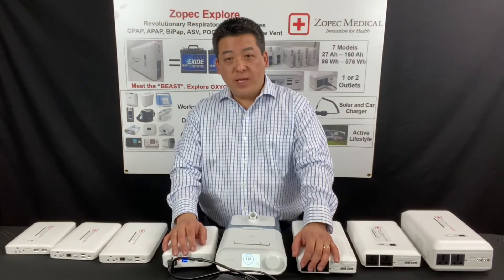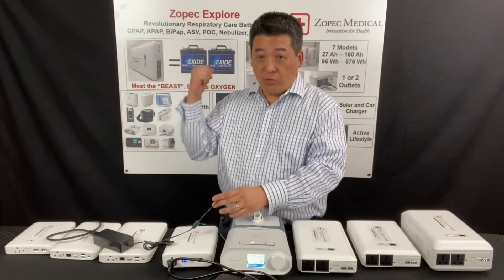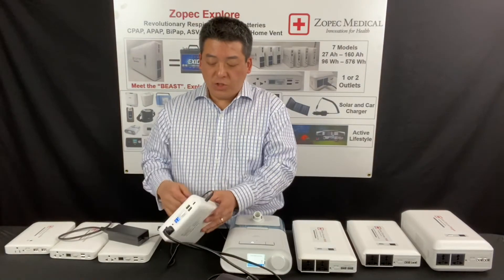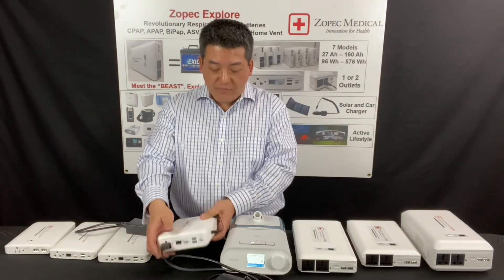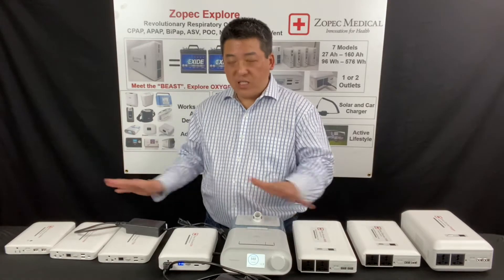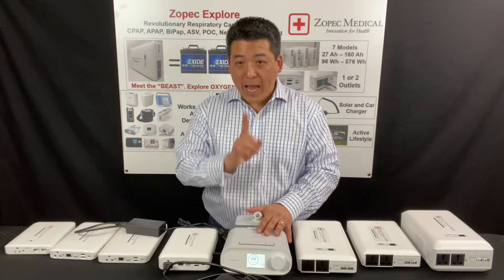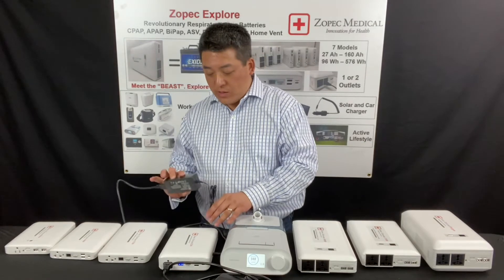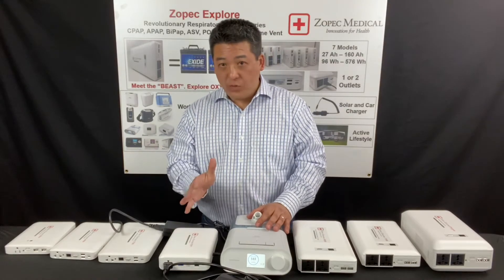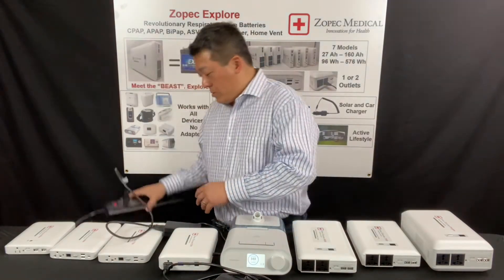Now we talked about UPS — let me do a demo. To set up the UPS when there's no power outage, it's running on wall power. You have to plug in the power supply as if you were charging the battery, and then you have your CPAP plugged in and running. The CPAP is not running on battery power right now — it's running on wall power. The wall power is coming through the wall charger and going through what's called pass-through, which is part of the UPS, to run the machine.